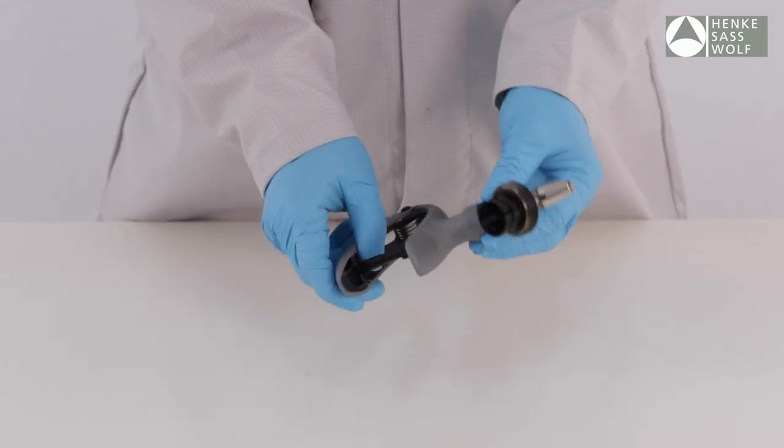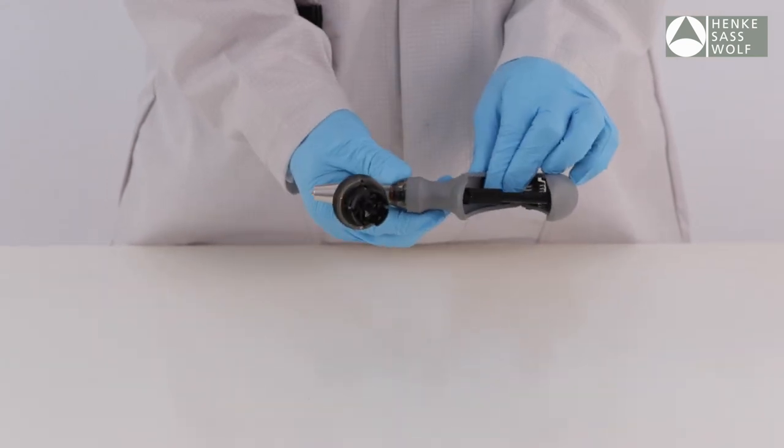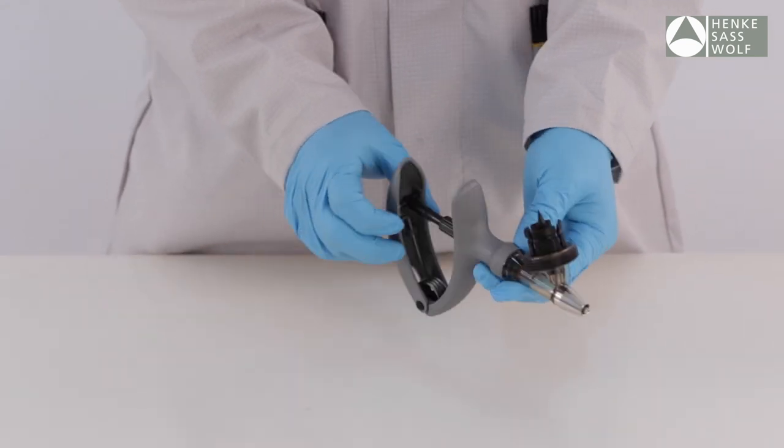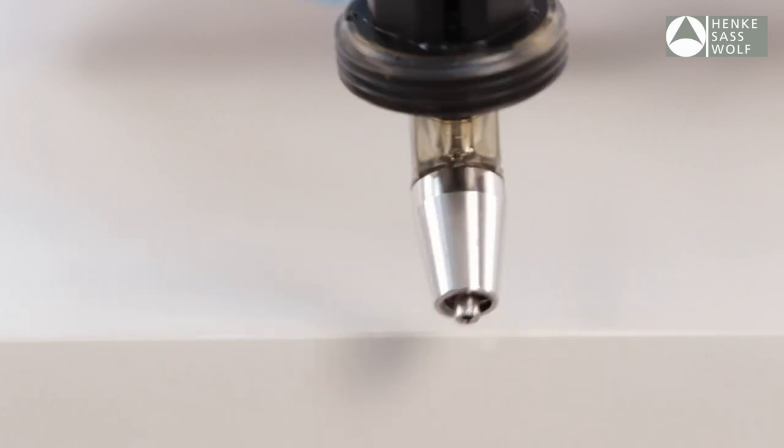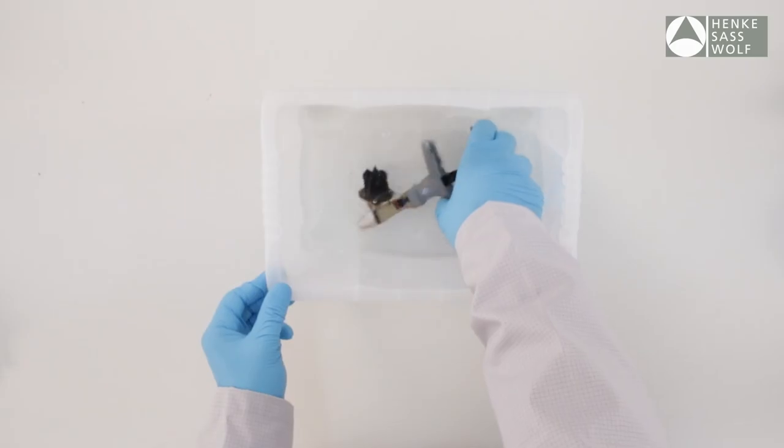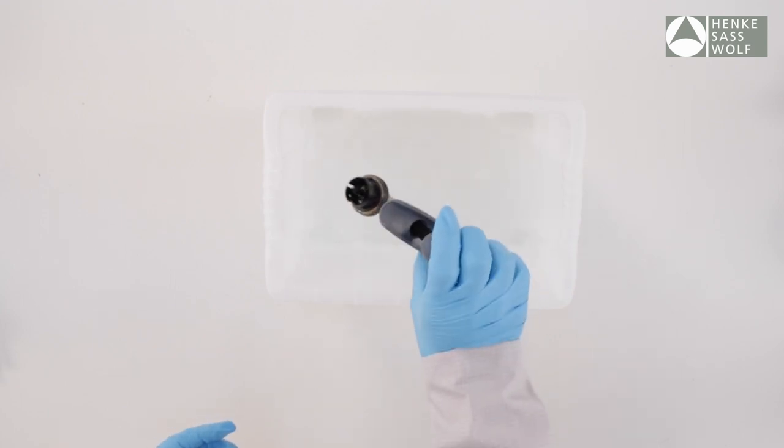In case the syringe is drawing air, the front valve behind the metal needle nut might be closed. The valve can be released by gently tapping the front of the syringe against the edge of a table and afterwards rinsing the syringe with warm water.